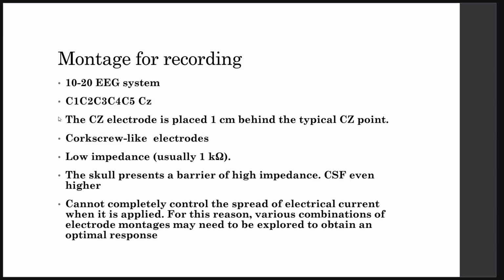But in motor evoked potential, it is not like that. You go 1 centimeter out of your active area, you will not get motor evoked potential. You will make the patient jump over the bed and you will not get any potential. So stimulation points are meticulously important in MEP.